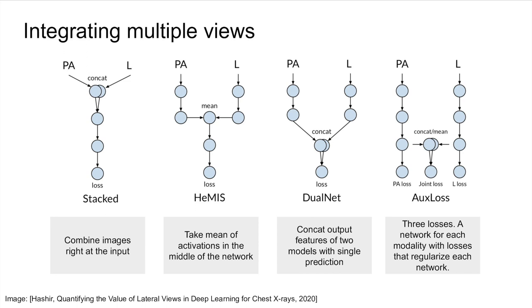There are many approaches to take advantage of multiple views with neural networks. We can combine the inputs by concatenating them together at the input, which is a simple and basic approach. This works if the sizes are similar, but doesn't make much sense if the views don't share common image features, and generally requires both views be present at the same time. An alternative called Hemis is to run independent networks for a few layers and then take the mean of their activations somewhere in the middle of the network. Taking the mean allows for one or many views to be present.